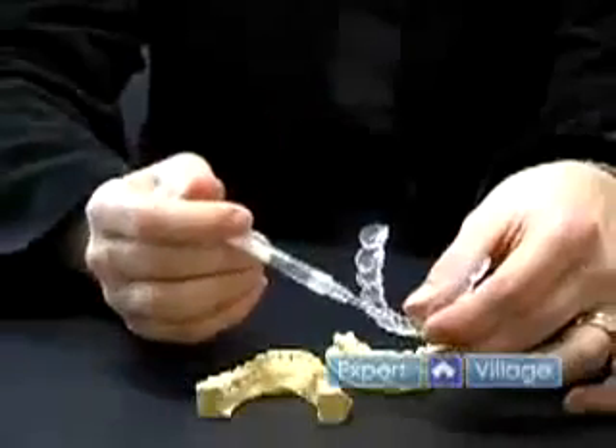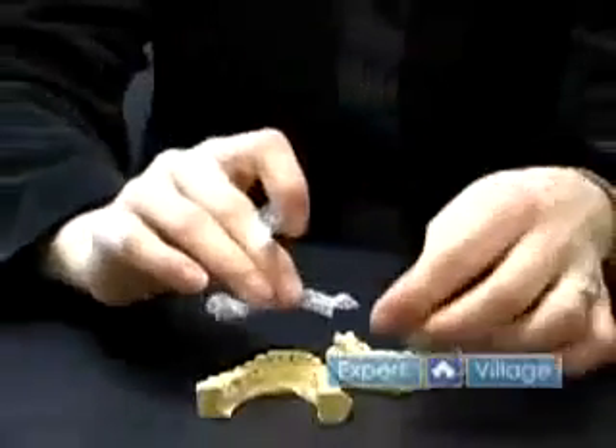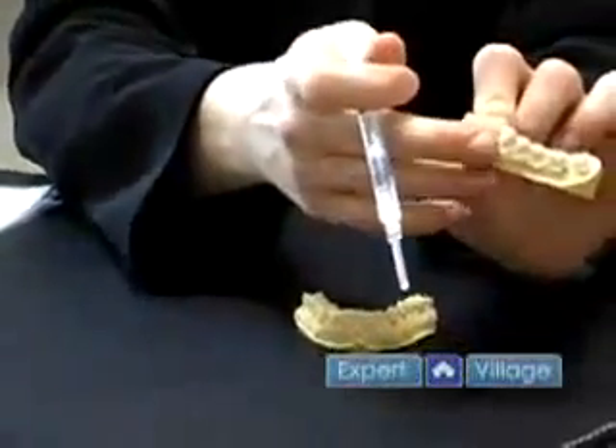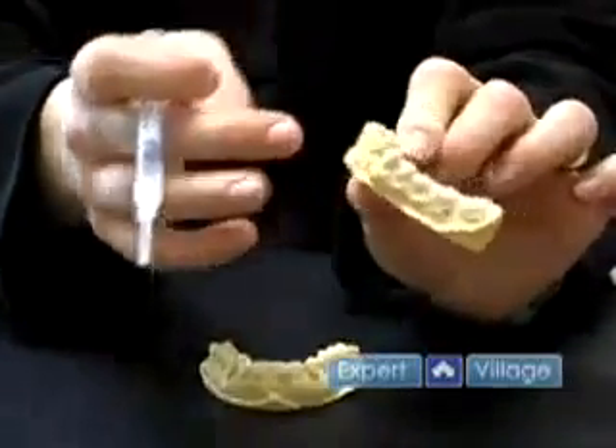You apply a small amount of the gel onto the internal surface and then you would put the tray into your mouth, over your teeth, squishing it right down so it fits snug over your teeth. Any gel that would come out the bottom of the tray would be wiped away either with your toothbrush or a dry cloth.